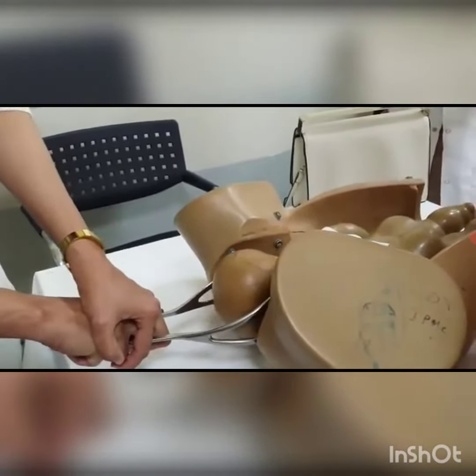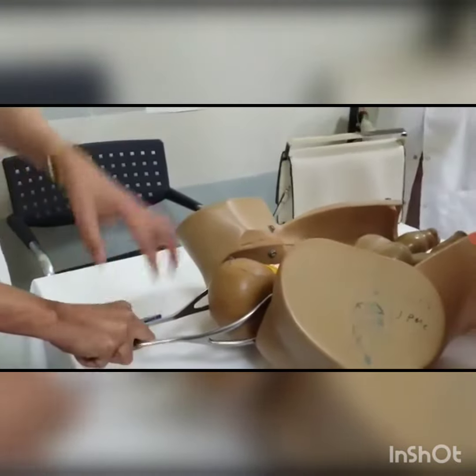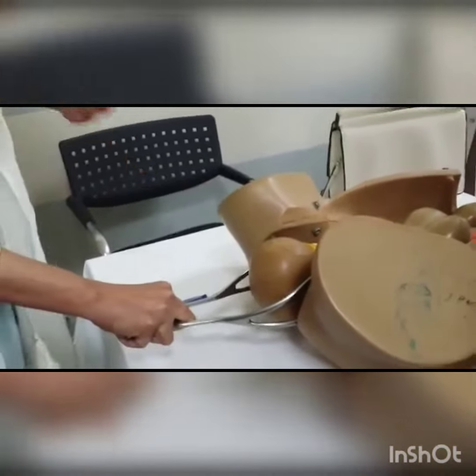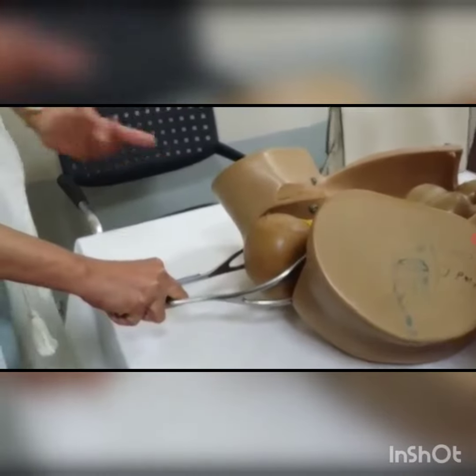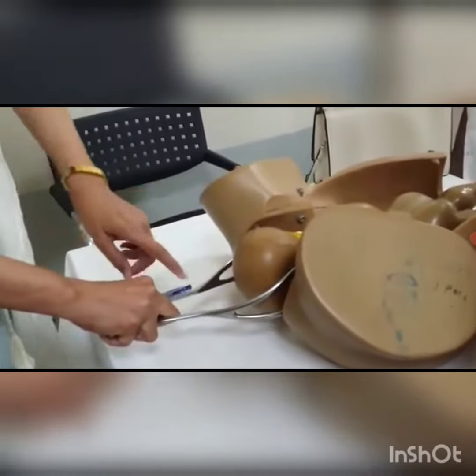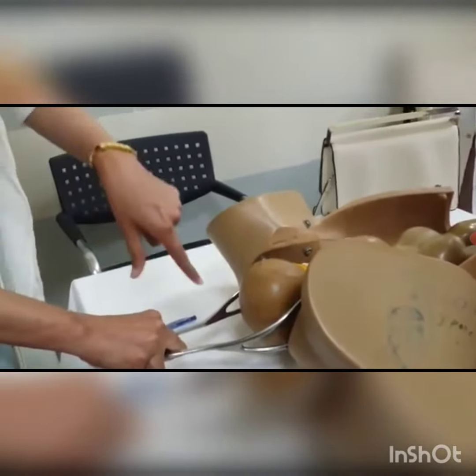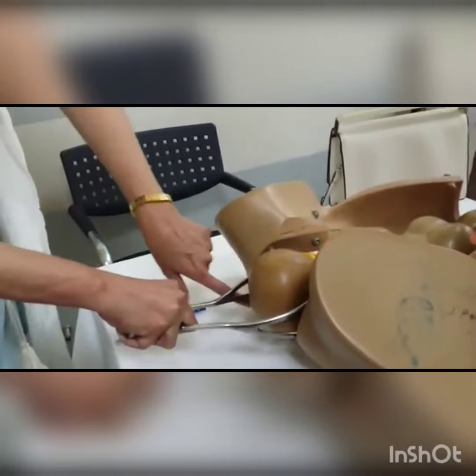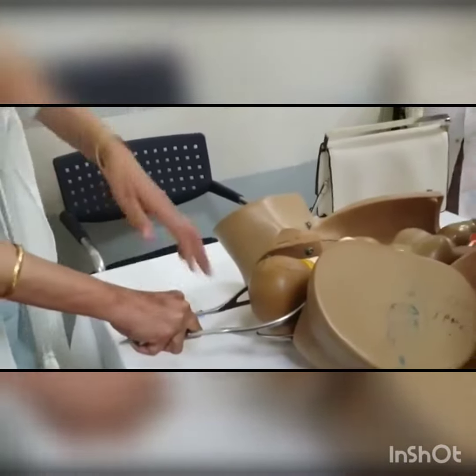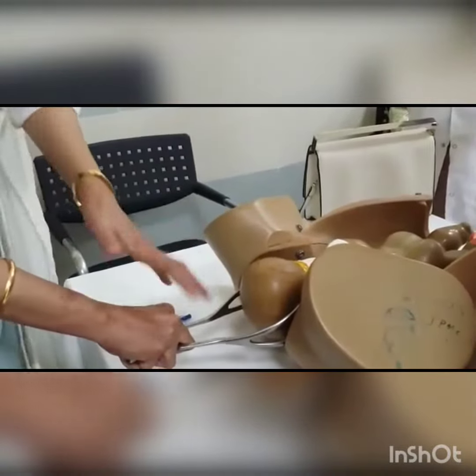The most important trick here is that you have to wait and let the head of the baby descend quite well, and assist that movement of the baby in the downward direction. As a consultant, when you feel the head is descending, make an episiotomy according to your assessment, and then wait for the forceps to assist your movement.